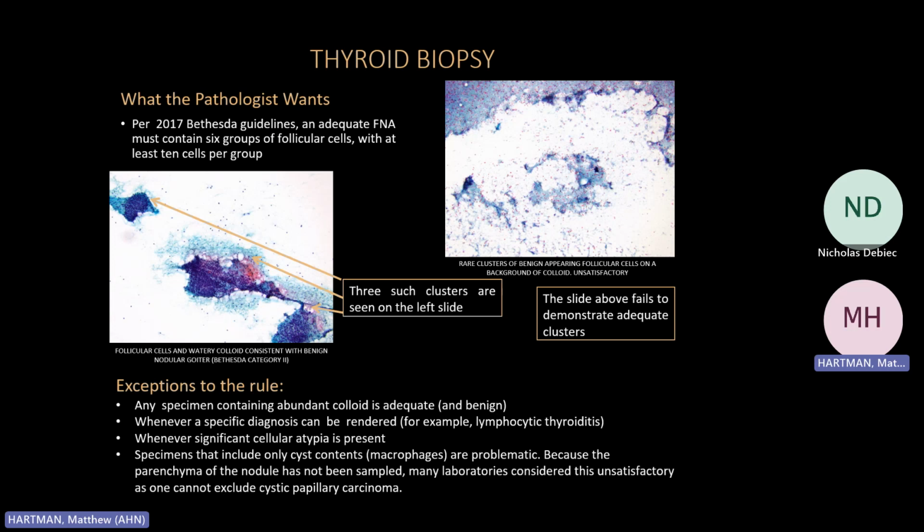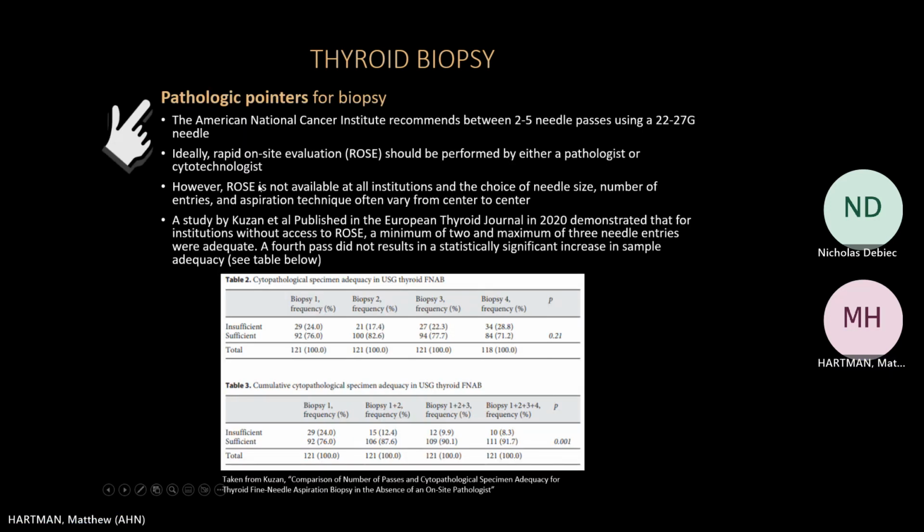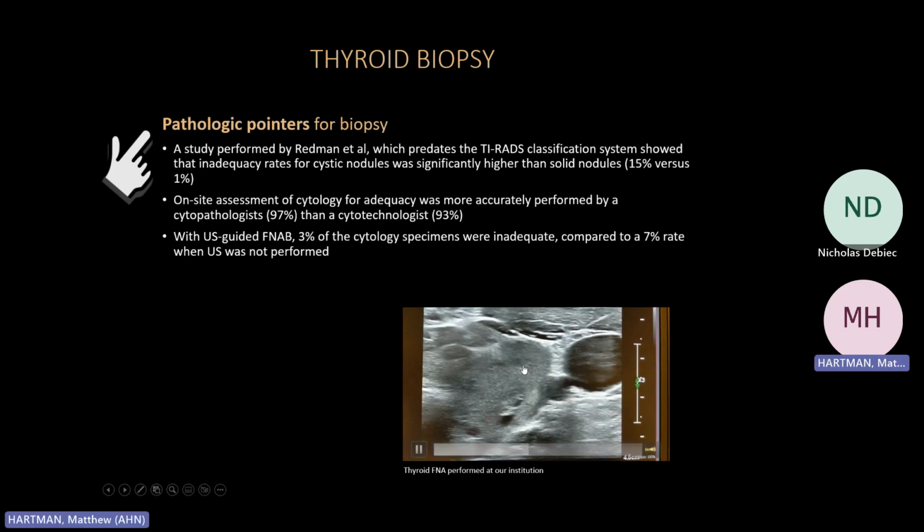You could keep biopsying 100 times, and I'm telling you, some of these thyroid nodules are just very stingy, and you'll never get an adequate sample. That can be very, very frustrating, but fortunately, those are the minority of the cases, in which case you're going to follow up the nodules or do a rebiopsy. Here is an example of ultrasound-guided biopsy, our needle going in. We avoid the vessels and hopefully get a diagnostic sample.